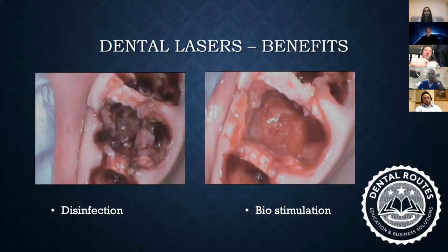Sorry, Koushik, sorry to make you go back to that one, because it's a fascinating question. So if you wanted to, for instance, clean that socket out, you would just put the laser onto soft tissue, and that wouldn't touch the hard tissue. It would just clean away everything in all directions as well, I'm guessing.